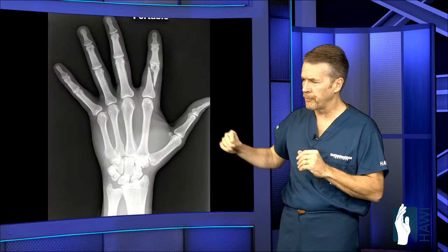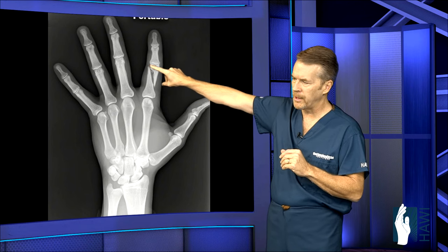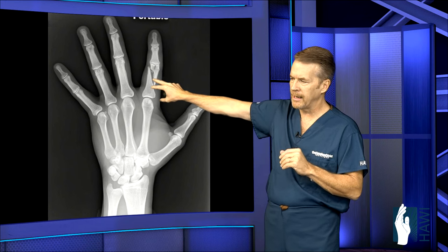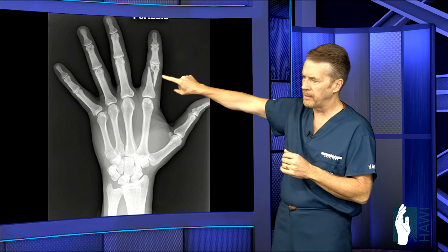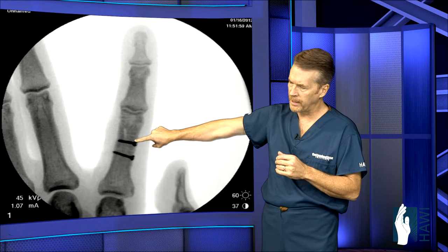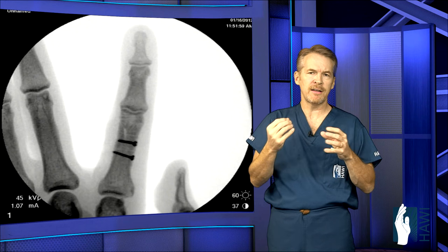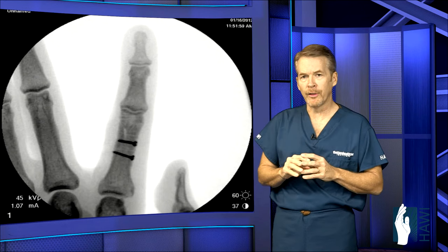Now let's look further into finger fractures. This image shows a significant fracture of the index proximal phalanx extending into the joint, but it was not separated, so we were lucky there was no true joint involvement. We cut open the back of the proximal phalanx, split the tendon, and put two screws in. You can see the screws compressing the fracture with anatomic alignment — these are low-profile 1.5-millimeter titanium screws designed to stay in, though occasionally if one loosens it can be removed.